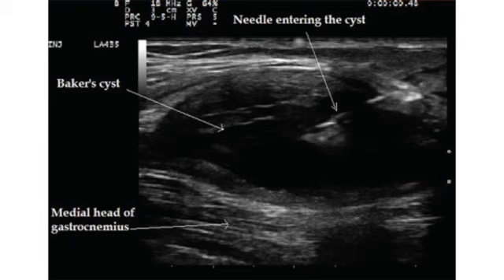This is a hypodermic needle. They're going to drain it, but it gives you a good sense of an ultrasound-guided injection or an ultrasound-guided aspiration. These are really nice because we can accurately tell, okay, I'm in that cyst, and I can effectively drain it as opposed to draining other tissues around it.